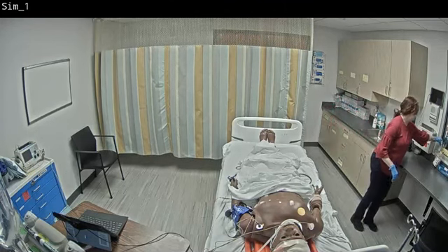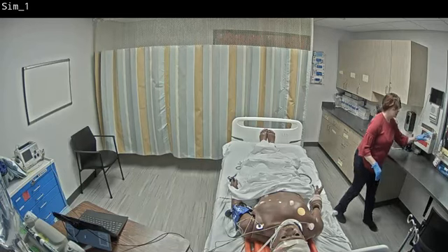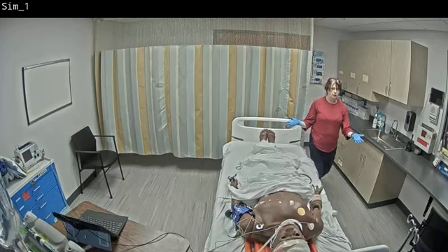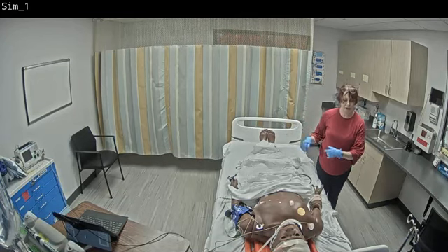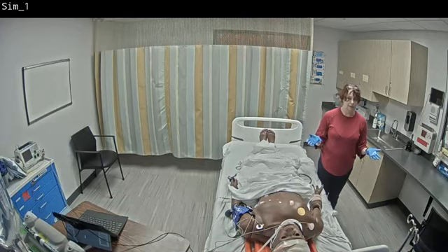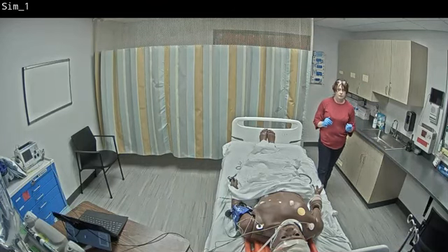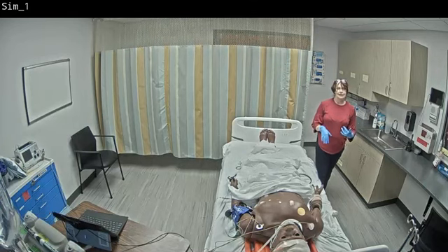Put your spray back up here. If you didn't use it, that's fine. You have it there should you need it. And then now the Freddy here is ready for the next participant to come in and do their Foley catheter or intermittent catheter insertion. If you get to simulation and you have questions, please feel free to ask.